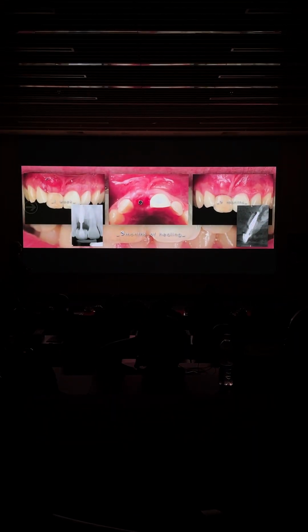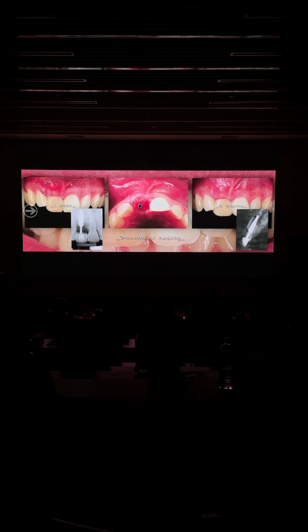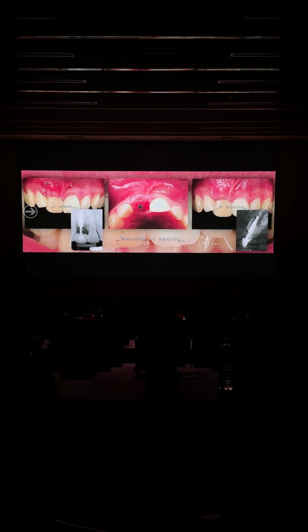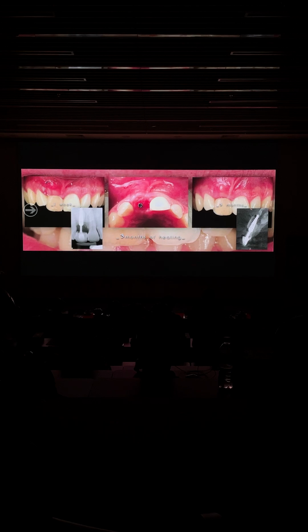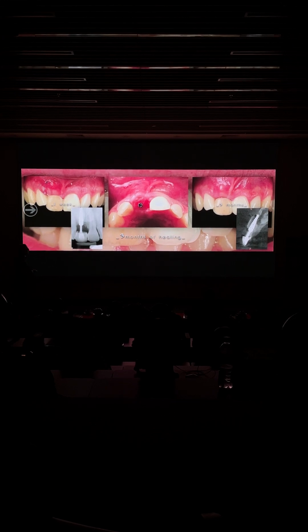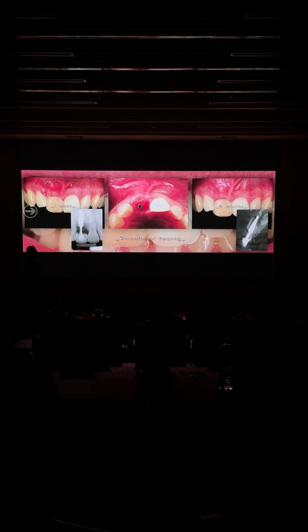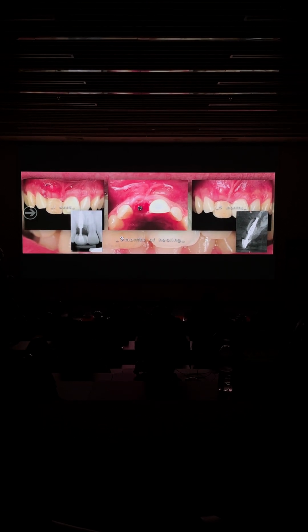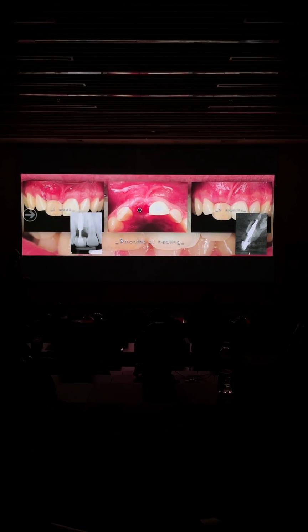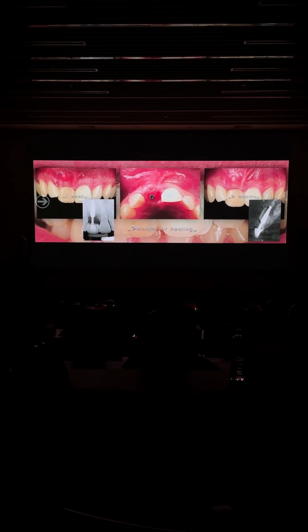3 months later, what I do is I take an impression. I already discussed yesterday, but I will get back to the issue of the depth of the implants on grafted sites. I place my implant at least 2 to 2.5 millimeters below bone, because under function you will always see a bone loss, a craterization around the implant. Quality of the bone is always bad at the crest, no matter what you do.